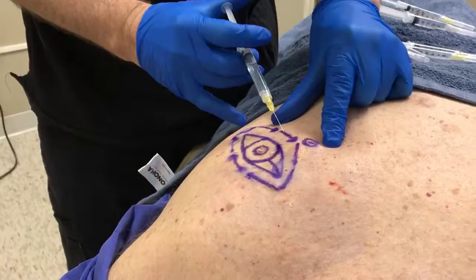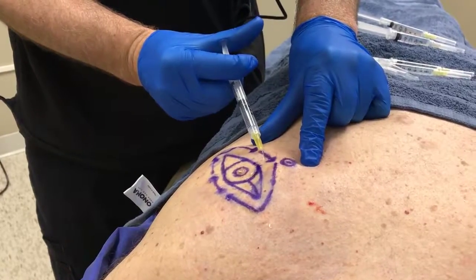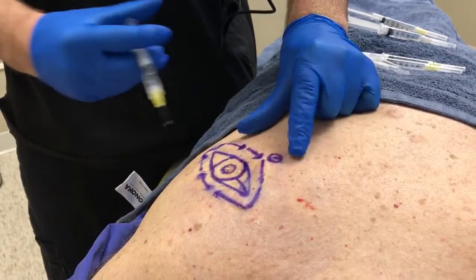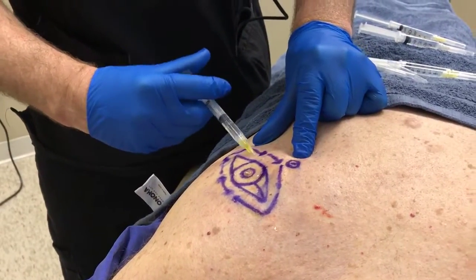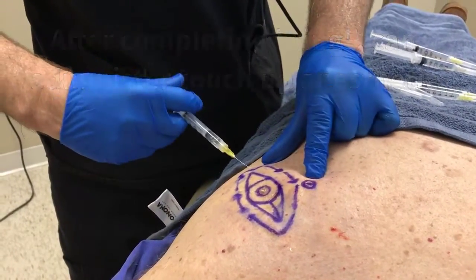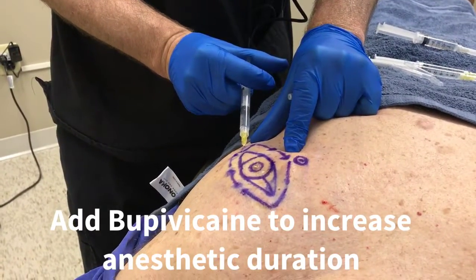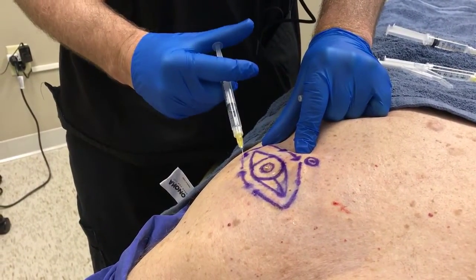It's important with each subsequent injection to administer the anesthetic where previous delivery has been given for optimal patient comfort. Touch-up anesthesia can then be performed using buffered lidocaine. If one would like additional anesthetic duration, bupivacaine can subsequently be administered, as we illustrate here.